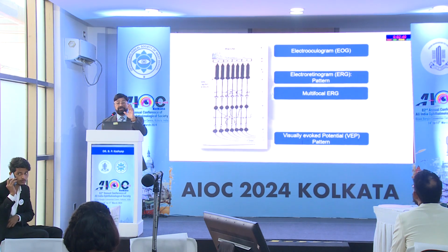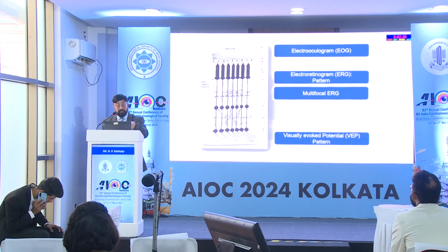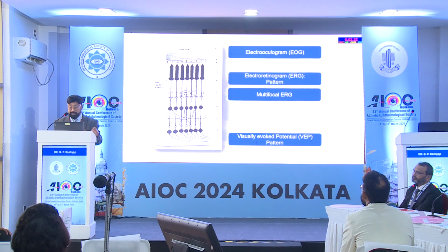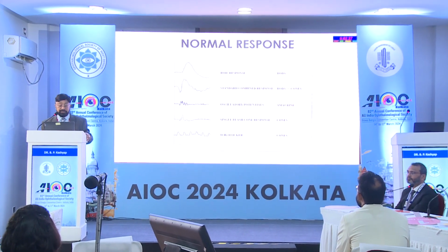But then you'll have to differentiate. So if you want to assess the central part, you go for a pattern ERG, or you can go for the multifocal ERG, apart from the full field ERG. So these are the normal responses of full field ERG.